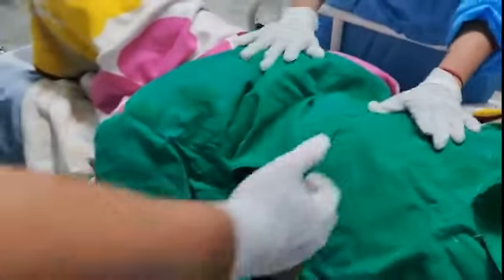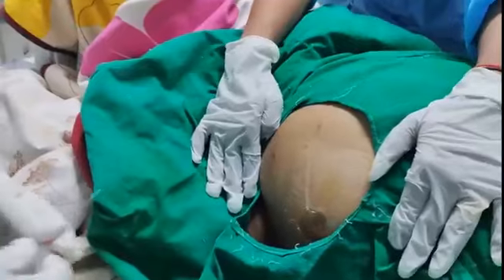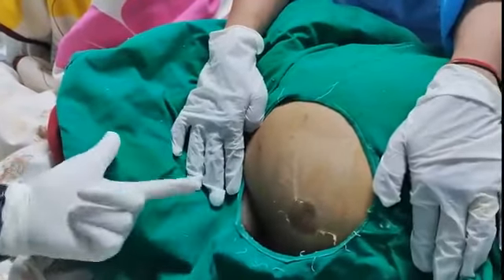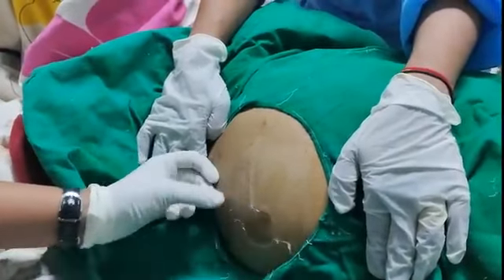For diagnostic paracentesis, select an 18 to 22 gauge needle. For therapeutic paracentesis, select an 18 to 14 gauge needle or a Caldwell needle. Smaller gauge needles lessen the risk of complications, such as ascitic fluid leakage, but take longer to complete therapeutic paracentesis. Insert the needle perpendicular to the skin at the marked site.